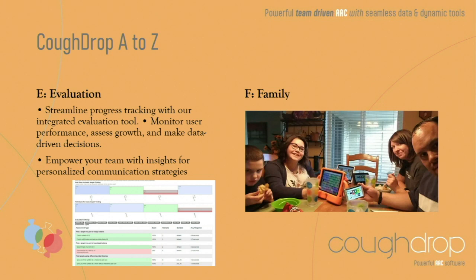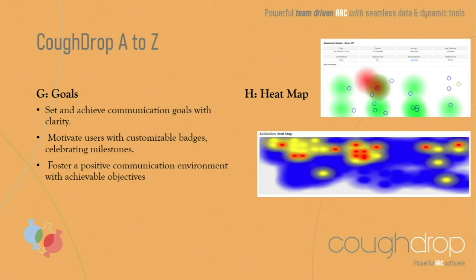Everybody is on different tablets, so you have an Android, you have iOS, right? You have a Kindle. Everybody, though, is looking at the same language. So then there's no expectation or identifying of who's using the communication device. We're all speaking the same language. And so getting family involved in supporting that communicator and giving them access to that vocabulary is so important.